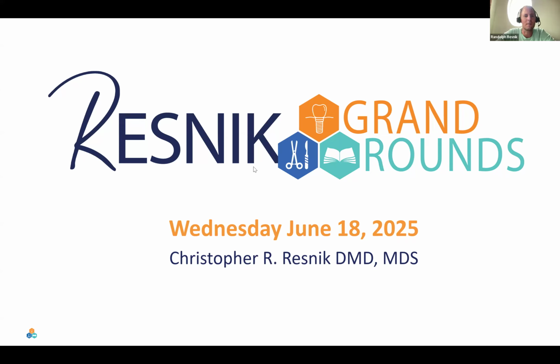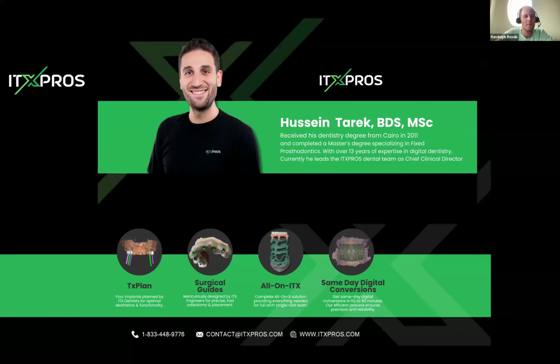We'll be going through cases with the CBCT and ITX today. So we're not going to have a lecture to start, because we have, I think, 9 or 10 cases to get through. So if you want to go to the next slide here, Hussein.